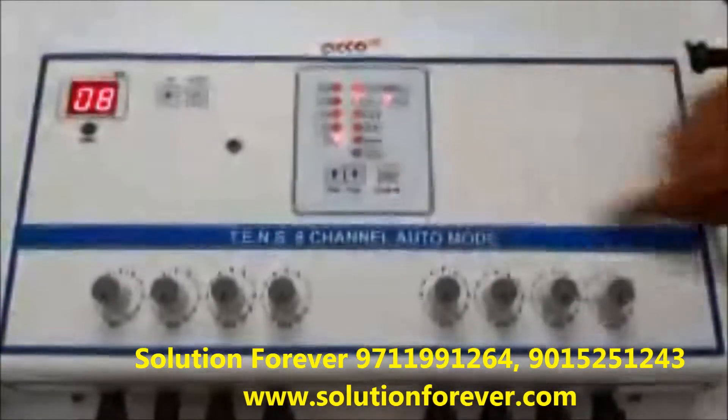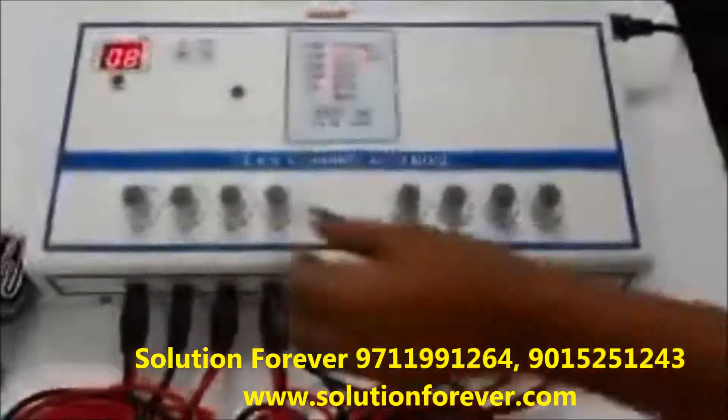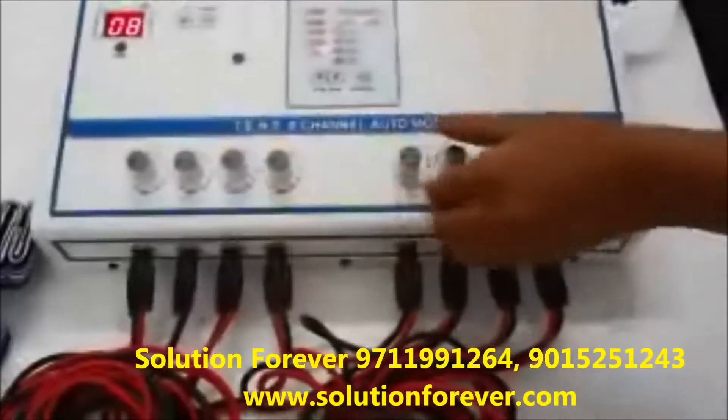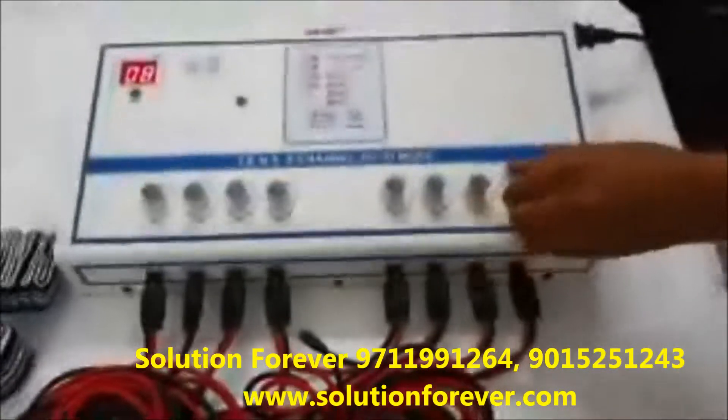Now press the start button and increase the intensity as per your need for each channel: channel 1, 2, 3, 4, 5, 6, 7, and 8.